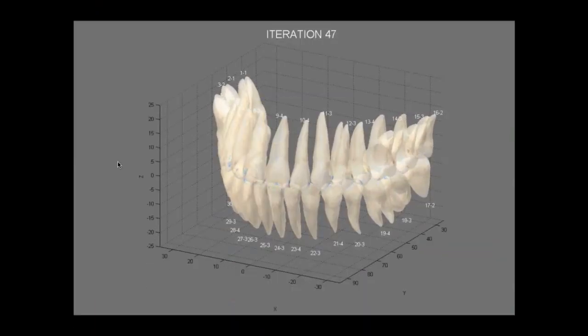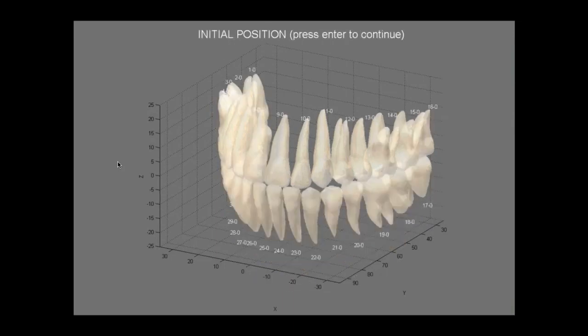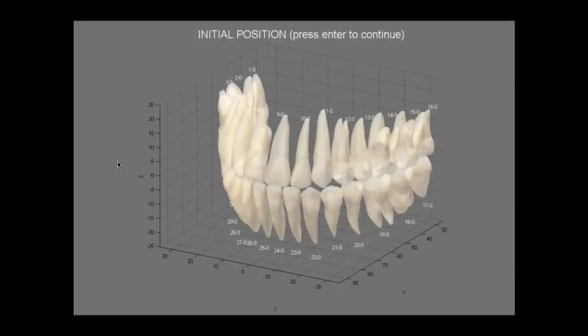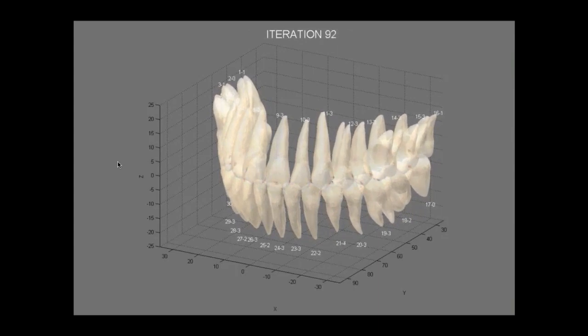The digital articulator. A lot of people have questions about, can I change articulator settings? How does the digital articulator work? And it really comes down to, once you get the teeth in position, you have the computer go through the digital articulation process where it refines and puts everything together into a fantastic occlusion.